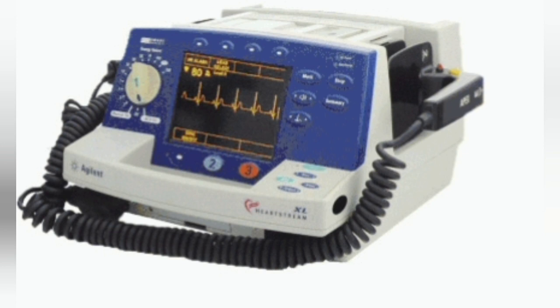The AC defibrillator uses AC current, and the DC defibrillator uses DC supply. Apart from that, based on the placement of the electrodes we have two types, internal and external defibrillators, which were discussed by the students in their video.